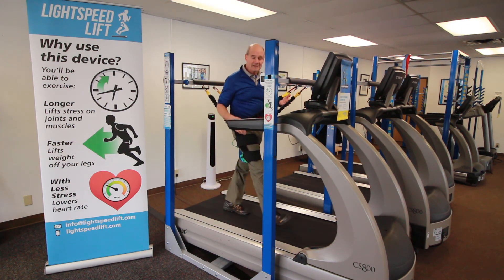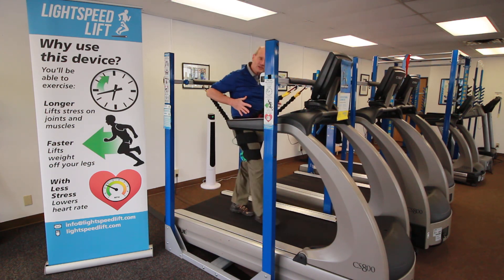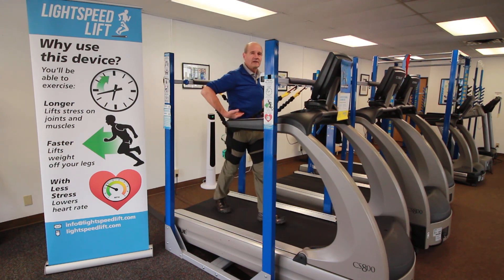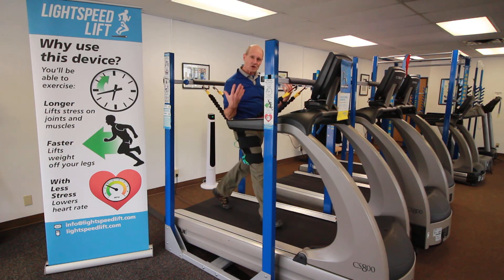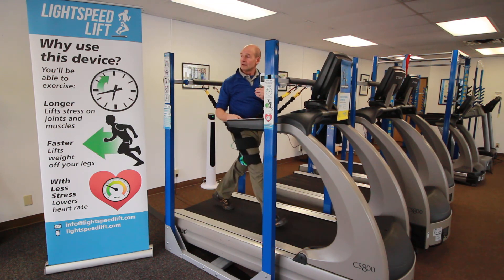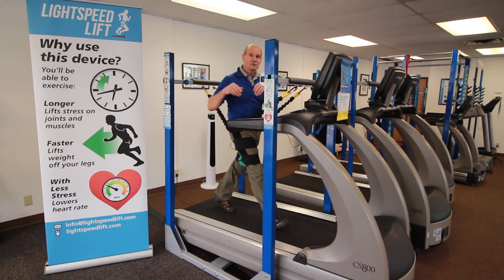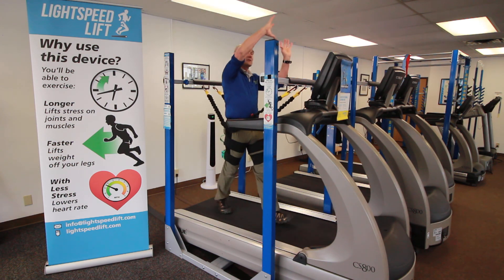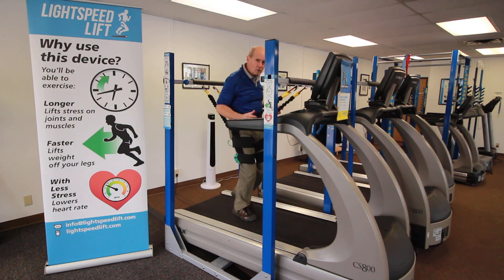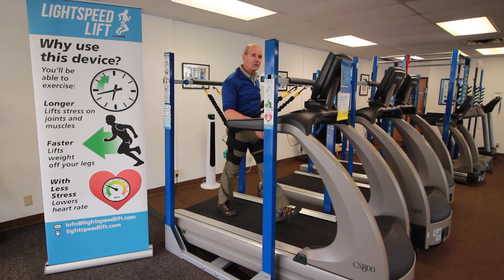Another thing that's so nice about this is I'm not disconnected. There's nothing between me and the floor, nothing grabbing my chest causing tension. My arms are free to move about. My head can turn side to side. I've thrown footballs and basketballs at people as they're moving about. Even at a slow speed, I can get into a little bit of a jog if I want to.